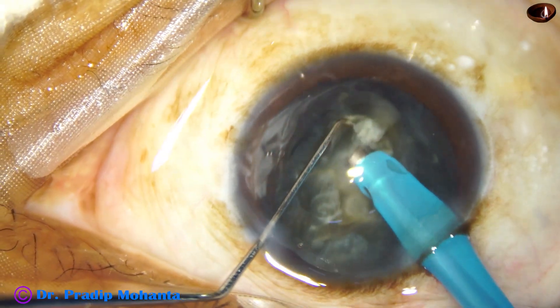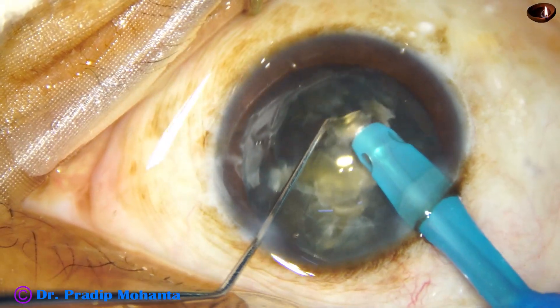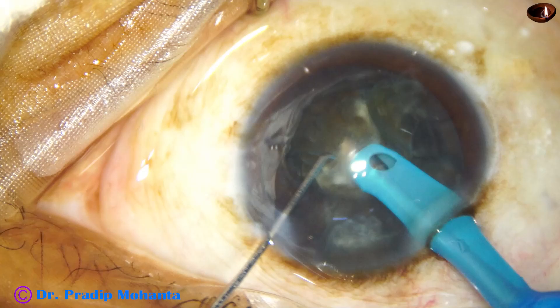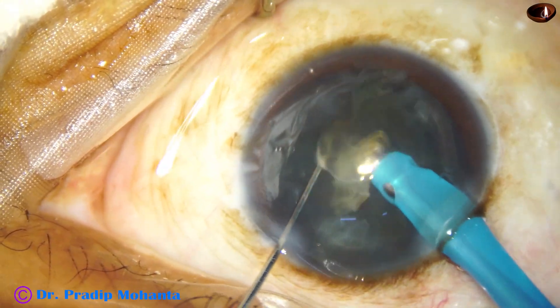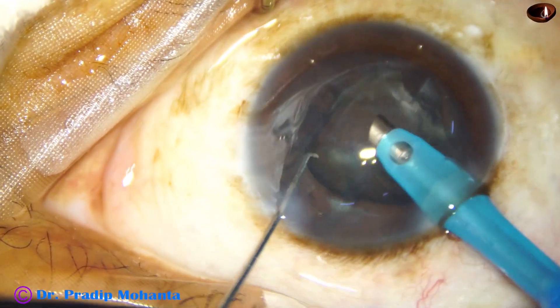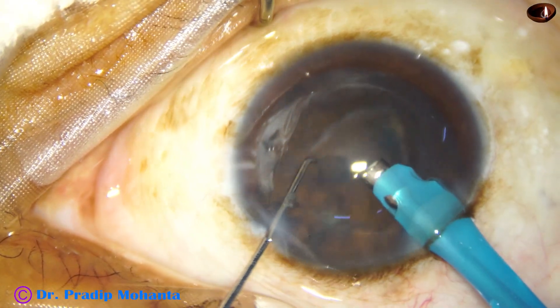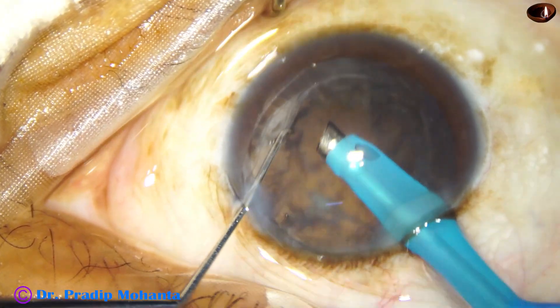This is the last portion of the nucleus. See what I'm doing — I'm peeling off the epinucleus from the nucleus and using the epinucleus shell to protect the posterior capsule. In a vitrectomized eye, if you have an accident, you don't get time — immediately the piece will drop to the macula, because the vitreous cavity is filled with just aqueous humor.